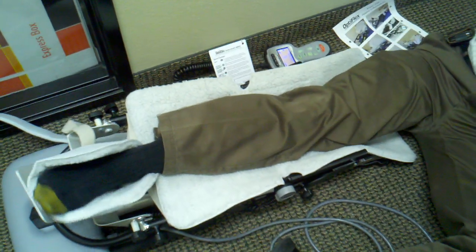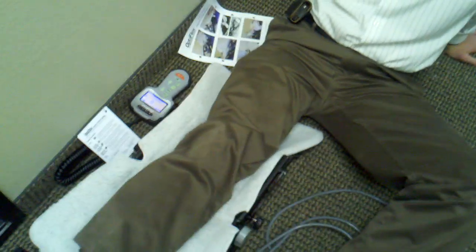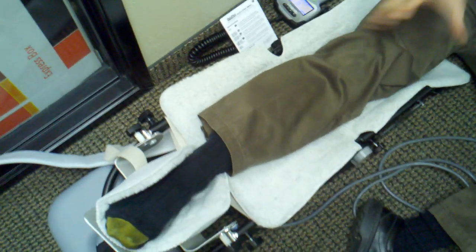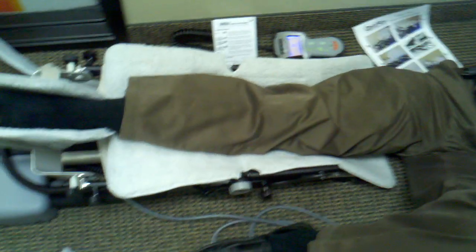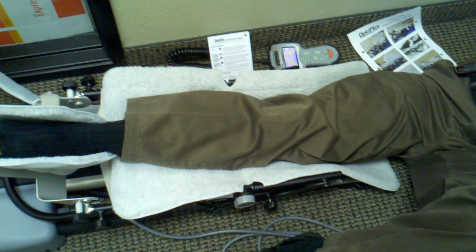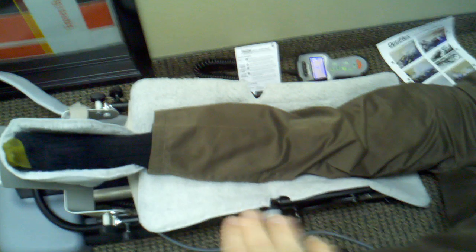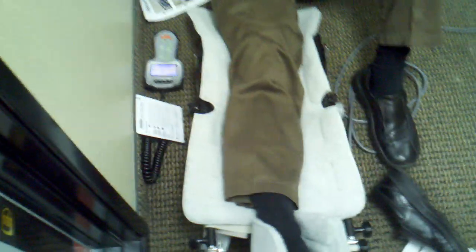The new thing about this one is you can actually move your foot side to side as well, so you can get some tibial motion. Have you seen other machines that don't have that option? Yeah, most of them are fixed so you don't have that option. And when we took this out of the box we noticed that it did sense it didn't have the zero degree, so it did give us a sensor error, which means it does have built-in sensors that will make sure that you accurately install it and get it ready, which is nice.